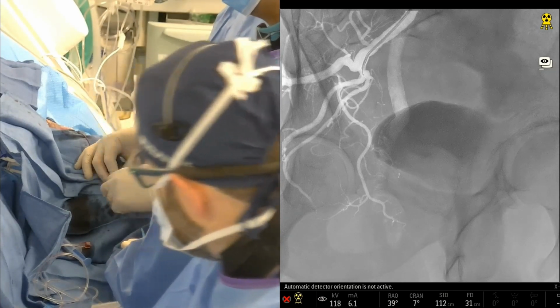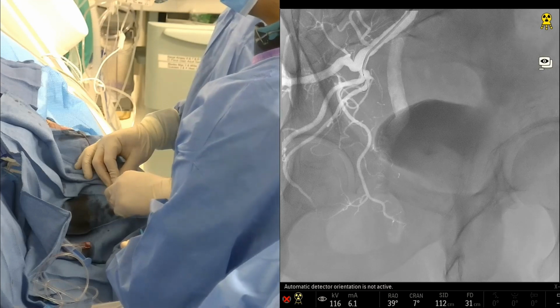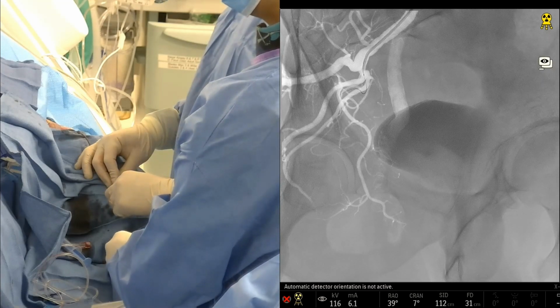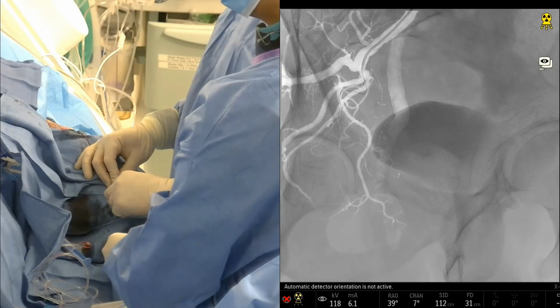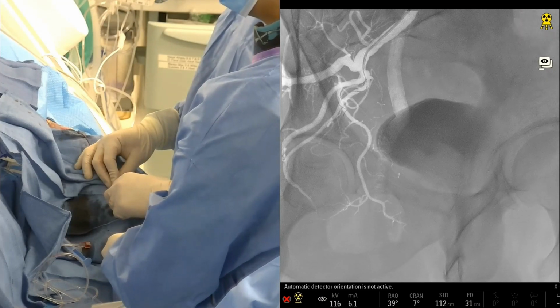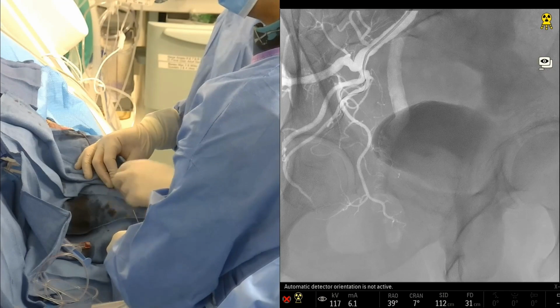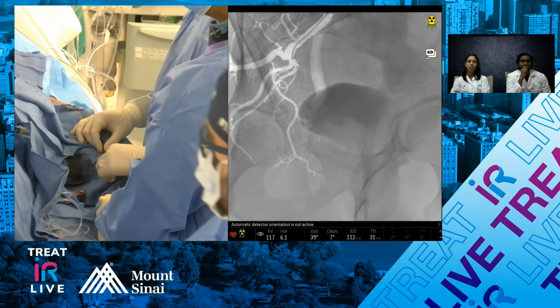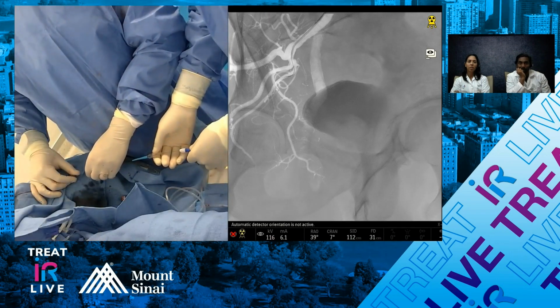Sorry, I missed that. So we switched. Keep going. That might be it. I thought it was a more lateral one, maybe not. That's the rectal, more posterior one. Do you want to shoot it? We can shoot it, but that's going to be good to check, because it's posterior to the prostate.